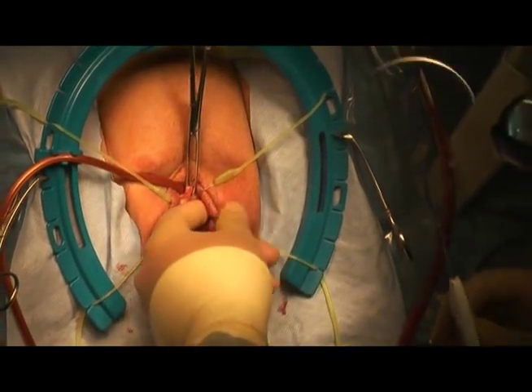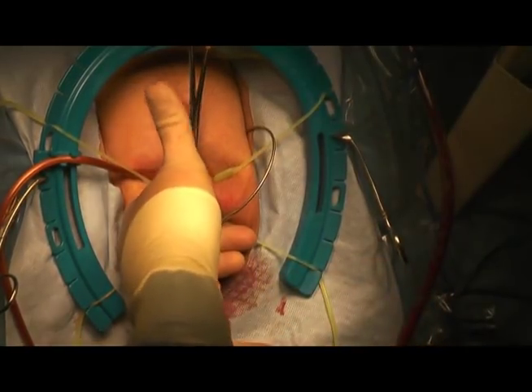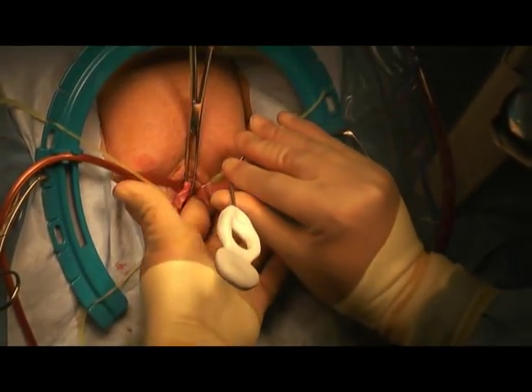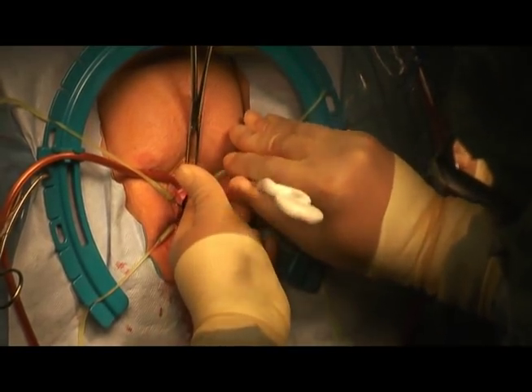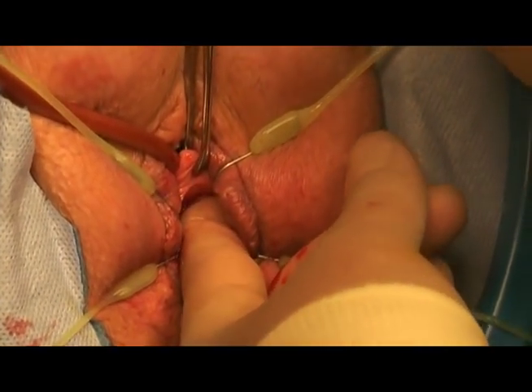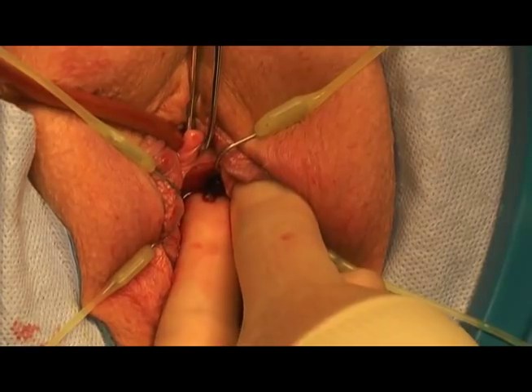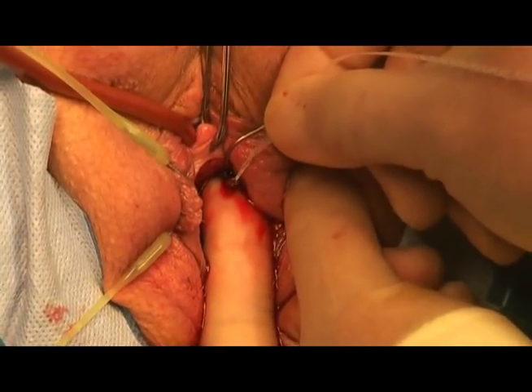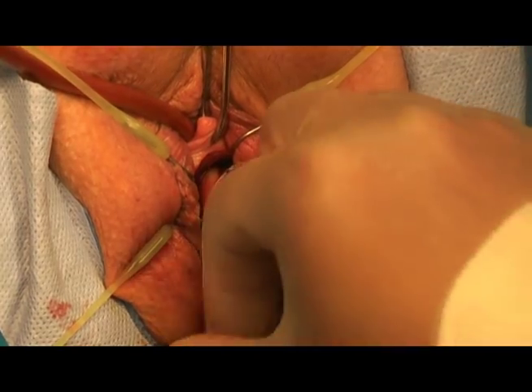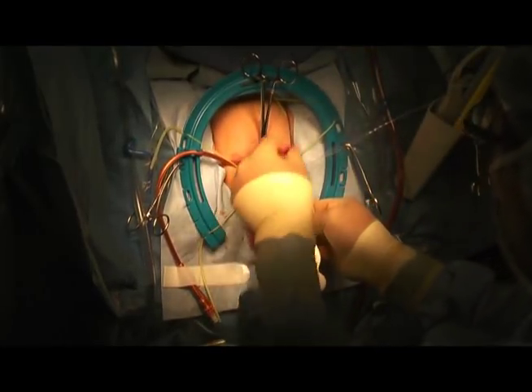Here you'll see me place my left index finger into the tunnel and my right hand holds the transobturator needle. My left hand will push the needle through the obturator space, then my right hand slides up — I don't use the grasper handle, but I actually put it on the curve and work it through so that my left index finger will feel the tip as I bring it out. I want to be as high up on the pubic arch as possible so that I'm not down at the urethrovesical junction. Once I have the eye of the introducer needle available, I'll put the end of the omnisure sling through the eye of the needle, pull it through with about five centimeters or more, and then reverse-turn the transobturator needle to pull the sling out through the groin.